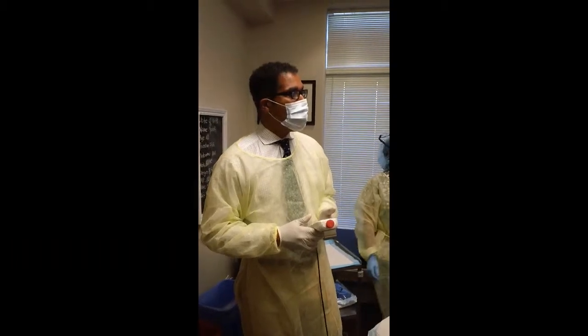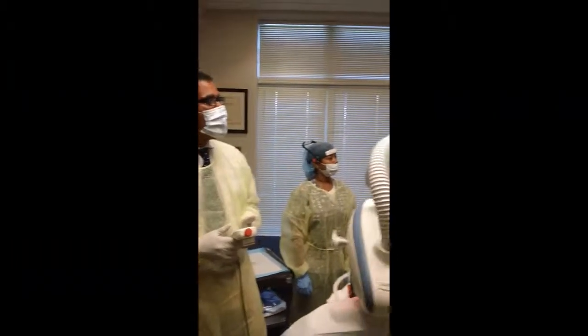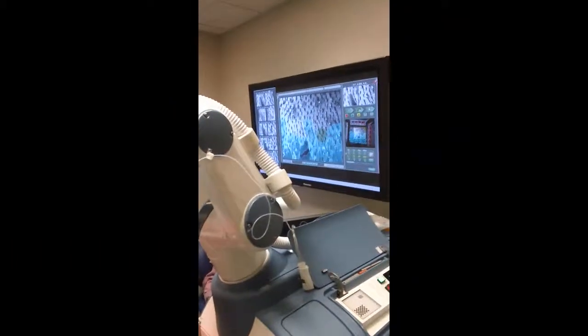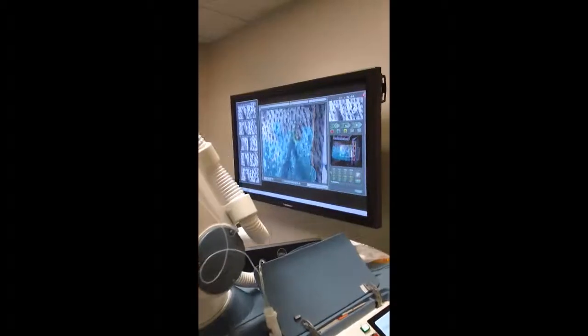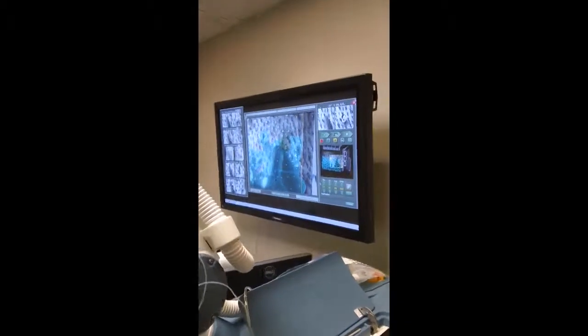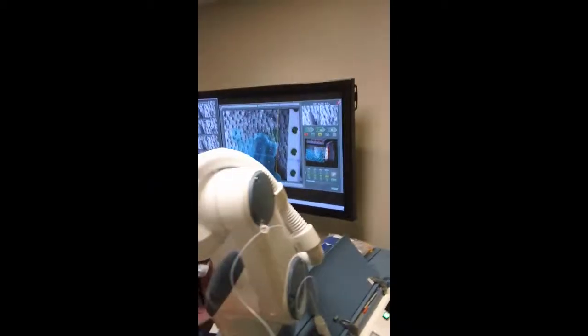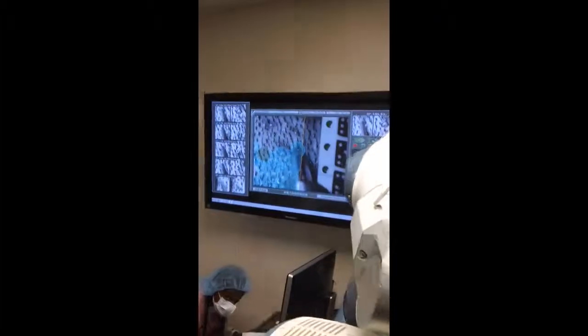The transection rate, we're probably at 200 grafts, and I'd say two that probably look transected at this point.